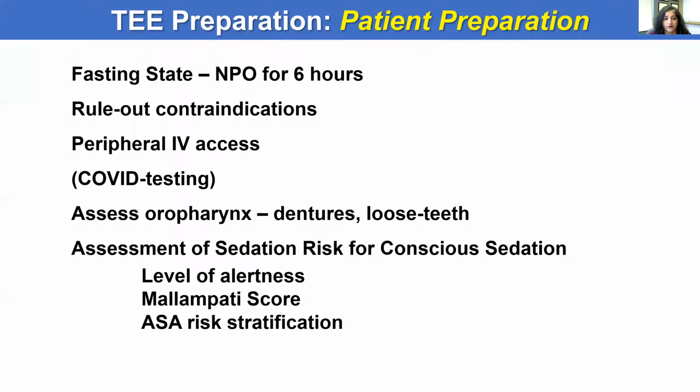You want to assess the oropharynx, so any dentures should be removed. Any loose teeth should be documented and watched. And then you want to assess the patient for their overall appropriateness for conscious sedation.